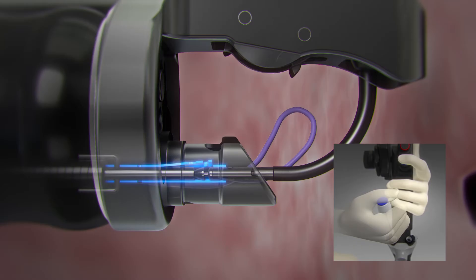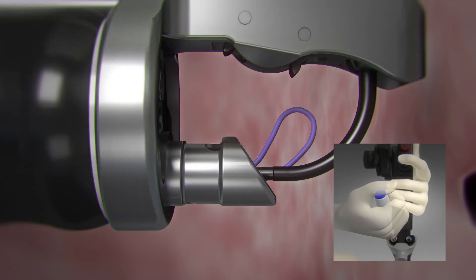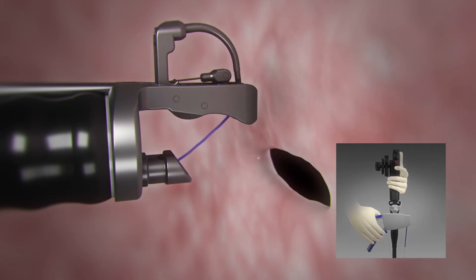Press the blue button on the anchor exchange catheter and pull back approximately one centimeter to disengage from the anchor exchange catheter. Open the needle driver handle.